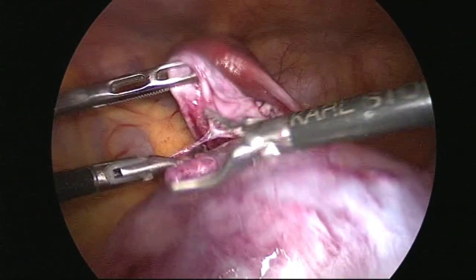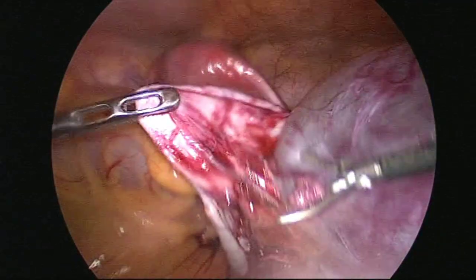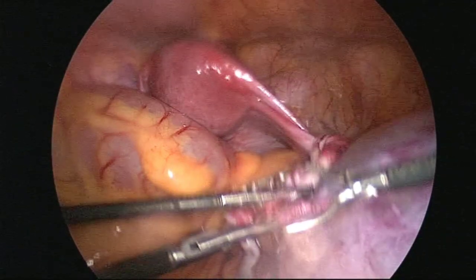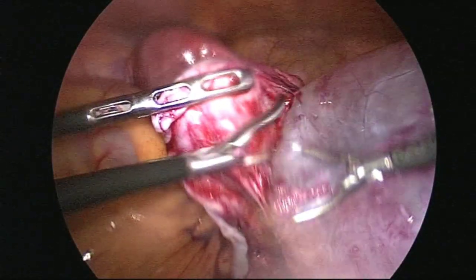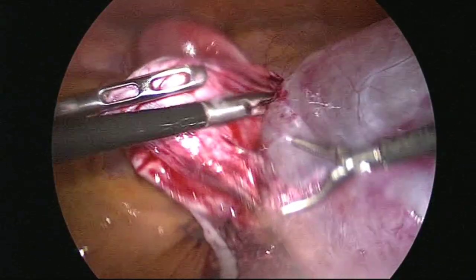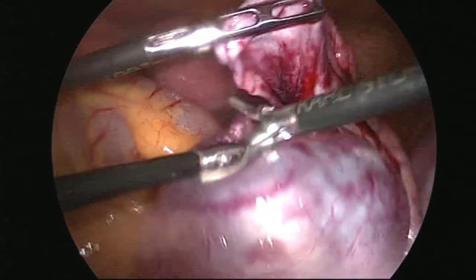This is the base, a little difficult. Now we don't want it to rupture.